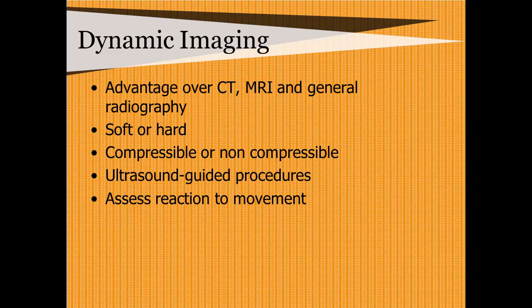You can use it to see if something is soft or hard, compressible, non-compressible, and you can use it as an ultrasound guidance procedure. So you can actually watch a needle and put it where you want it by guiding it. And you can assess a reaction to movement. What's causing the pain? So if the patient comes in with an arm abduction issue and they have pain with abduction, you can watch the abduction and see if there are things pinching, causing that pain.